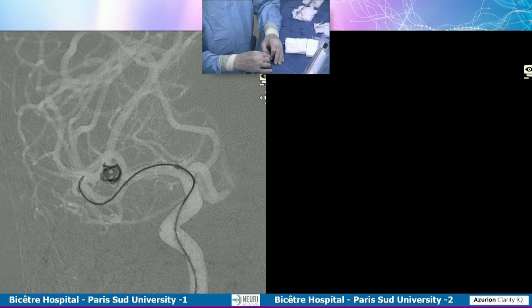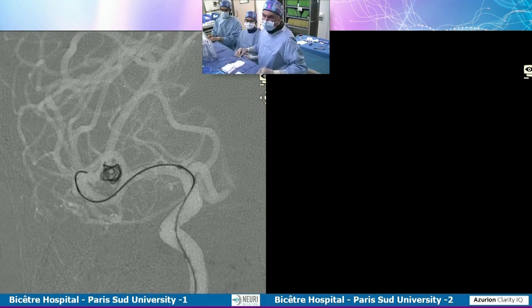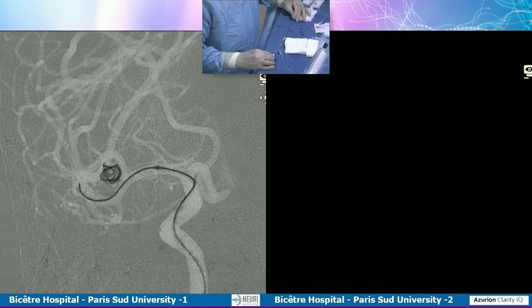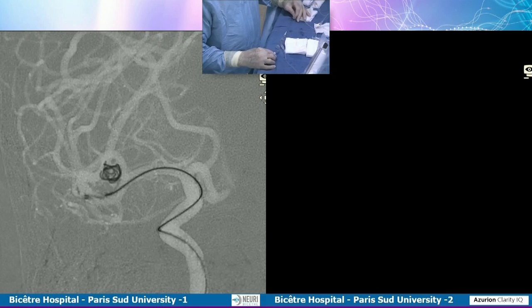At the end, I have the impression you just put the flow diverter somewhere in the bifurcation, and that's okay, it will cure the aneurysm. I was expecting that somebody would ask the question. I'm disappointed that it's you asking the question. No. You told me I am invited because I am stupid, no?